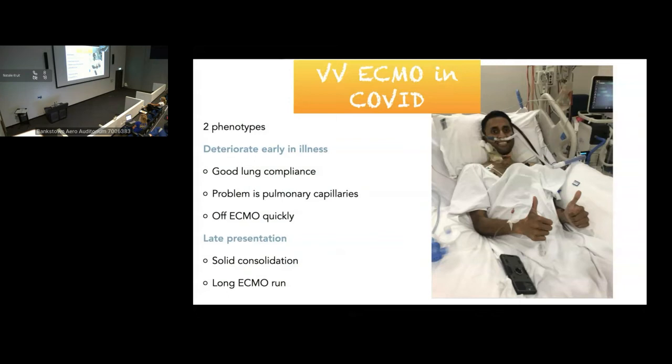In England, at least 25% of ECMO patients are getting ECMO for at least 5 weeks. So they're really long runs. A 55-day run is really not out of the ordinary. And the chest CT looks absolutely appalling. There's little to no lung parenchyma, but irrespective of the CT findings, particularly in the large centres or the large respiratory failure centres in the UK, the patients are turning around eventually, and we would caution against using CT as a prognostic tool.